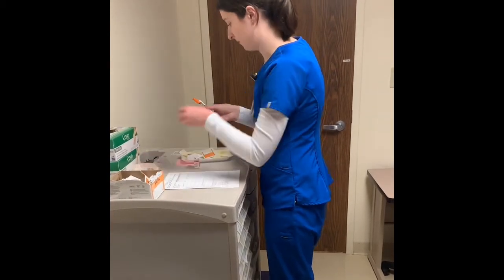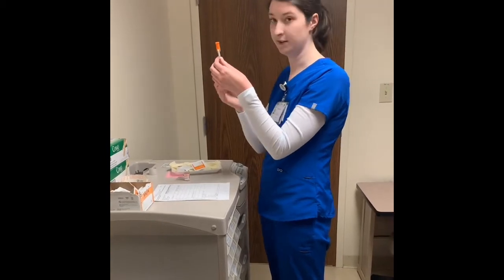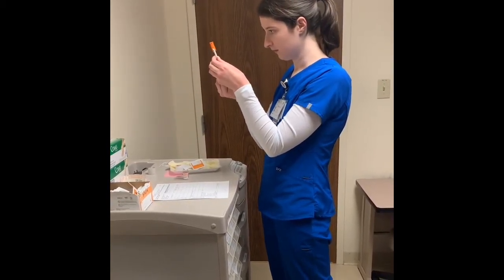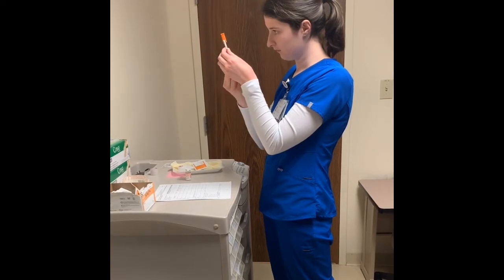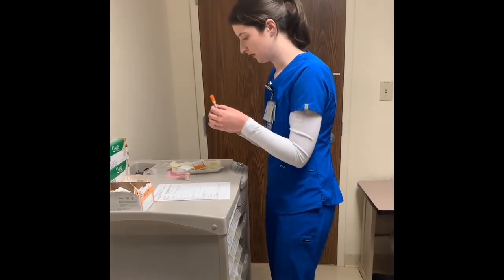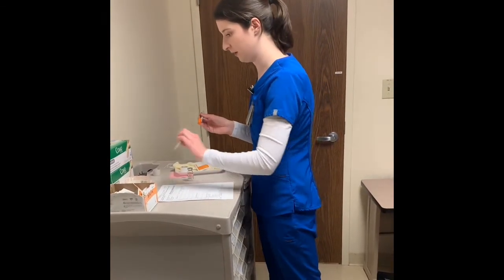And now, because I'm administering 20 units, I'm going to go ahead and draw up 20 units of air. Now that that is prepared, I'm going to go ahead and pull out my medication.